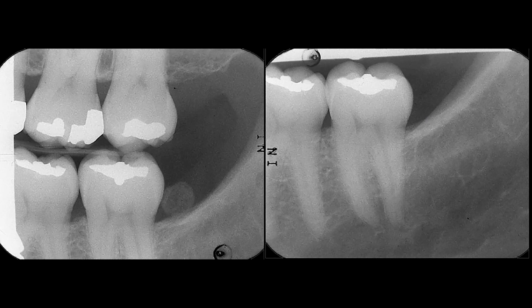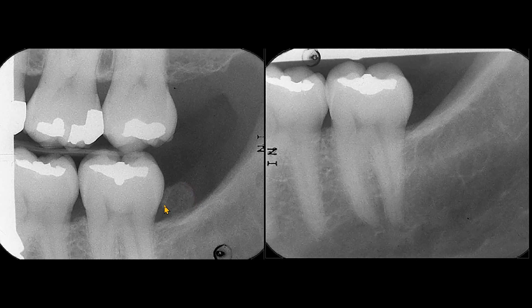So we can conclude that this radiopacity is not in the alveolar mucosa or in contact with the alveolar crest. Obviously, this radiopacity was on the path of the X-ray beam during the bitwing radiography. We see that the radiographic features are a circular or oval, well-defined radiopacity with a smooth outer border. The outer border is slightly denser than the inner part.